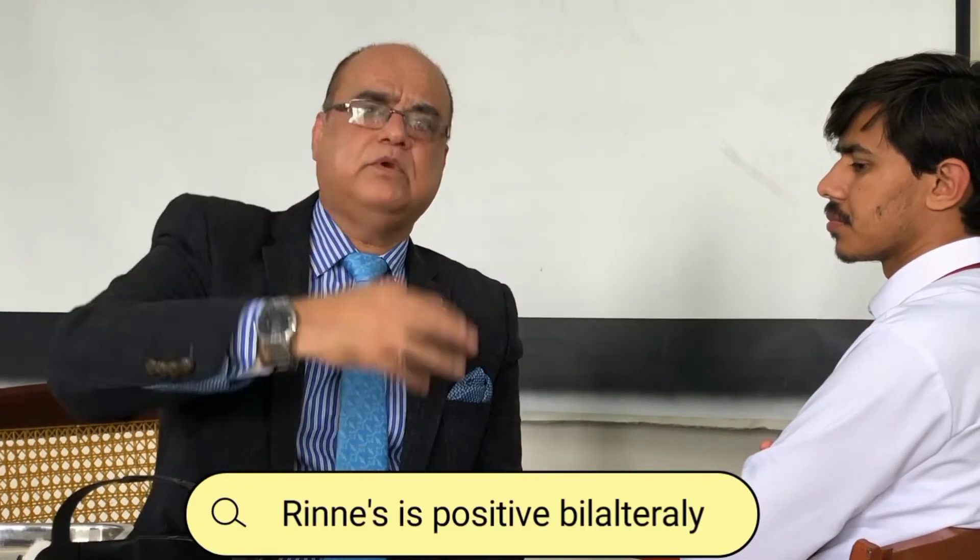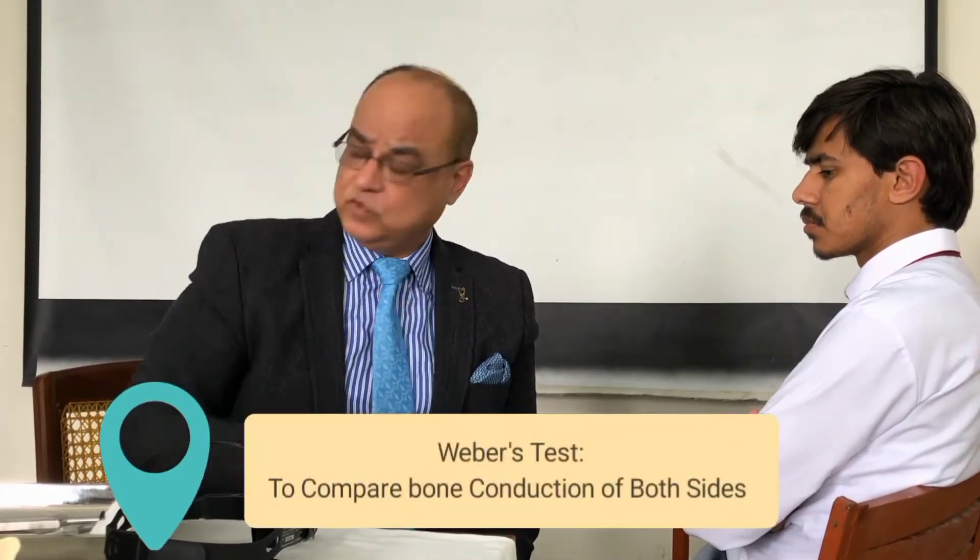Rinne is positive when air conduction is better than bone conduction. Similarly, this is done on the other side. When narrating the result, you say 'Rinne is positive bilaterally' or 'Rinne is negative on the right side,' depending on the situation. You describe it as positive or negative on both sides or on a unilateral side.